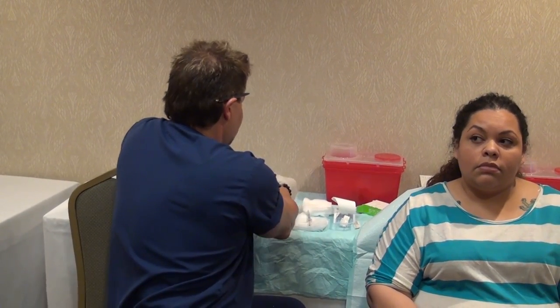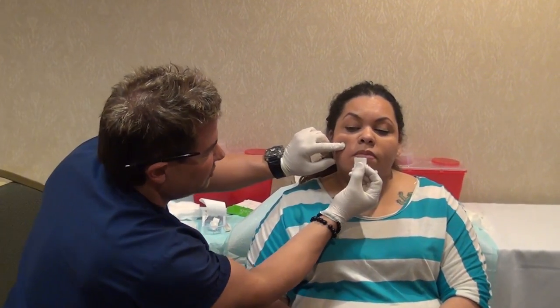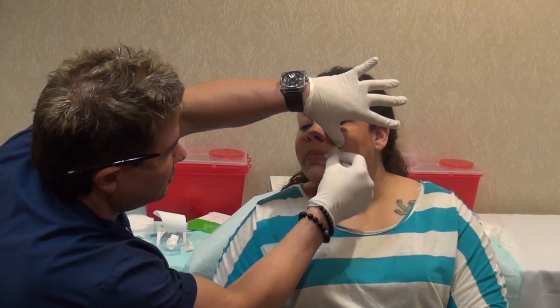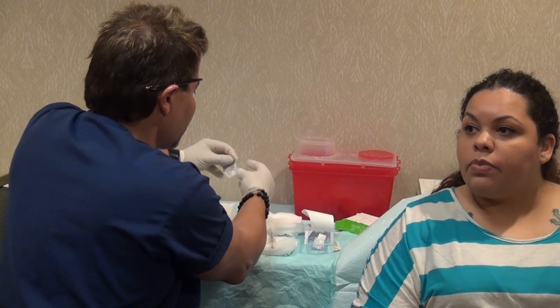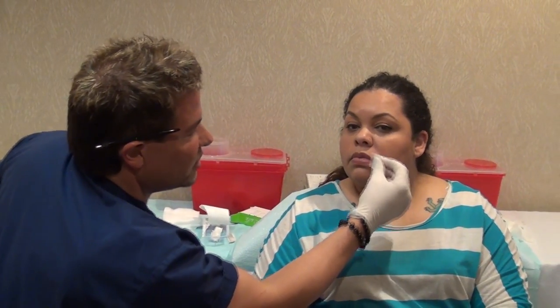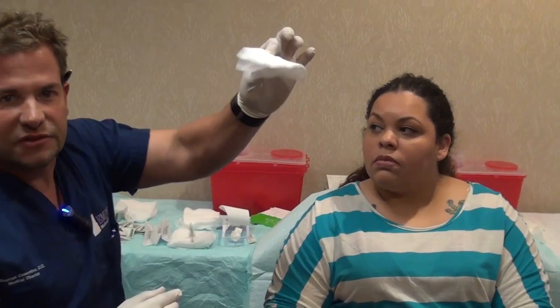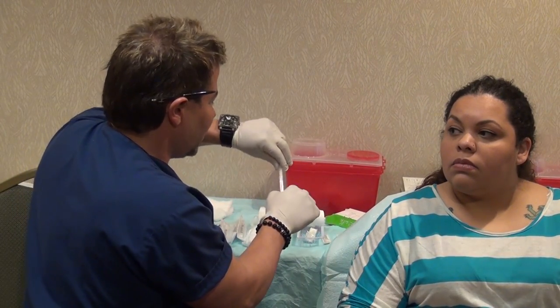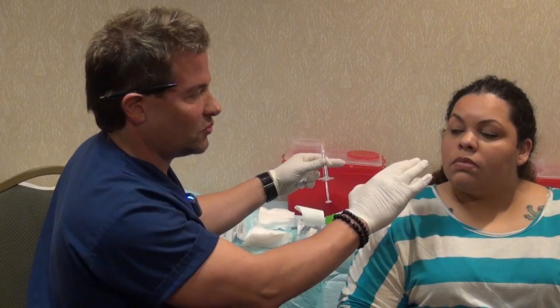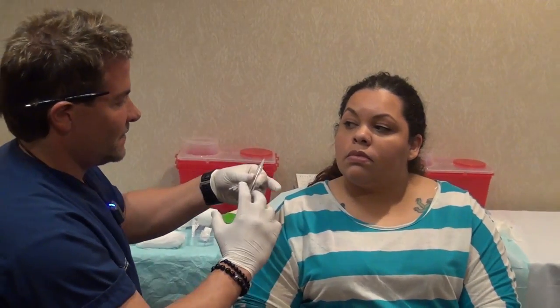First, try to make the area nice and clean. When injecting near the lips, patients often ask for water and lick their lips because the product is very hydrophilic — it draws water molecules in from the surrounding area and can dry the area out. That's not a problem, just what it does. Always have your gauze right next to you so if it bleeds a little you can dab it. The worst thing in aesthetics is blood dripping on the patient — it messes up their clothing and looks sloppy.